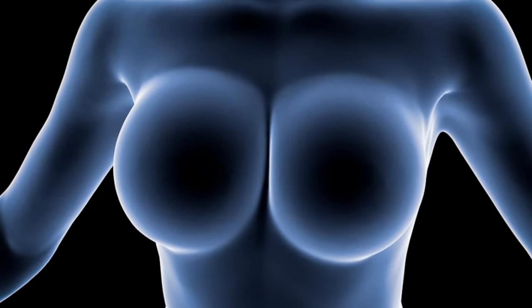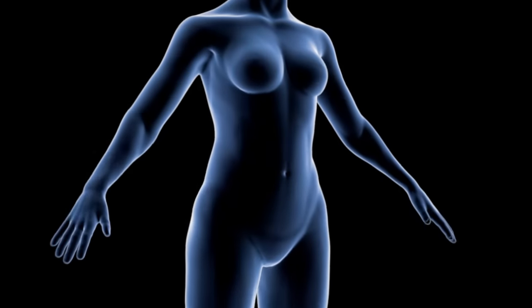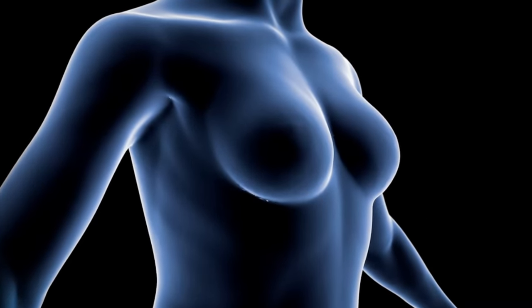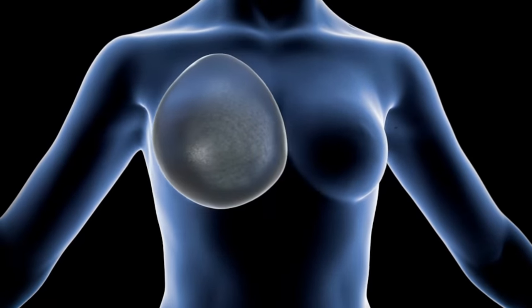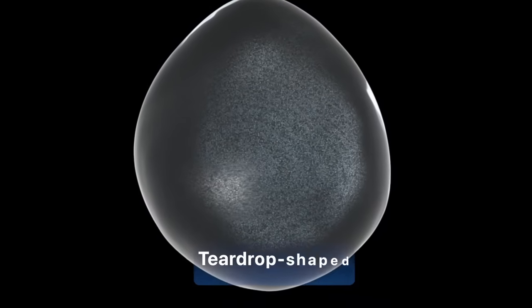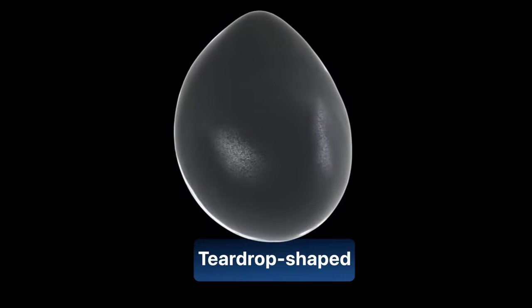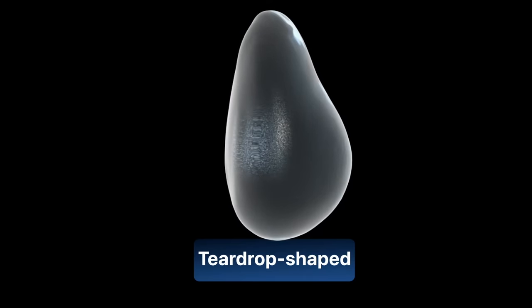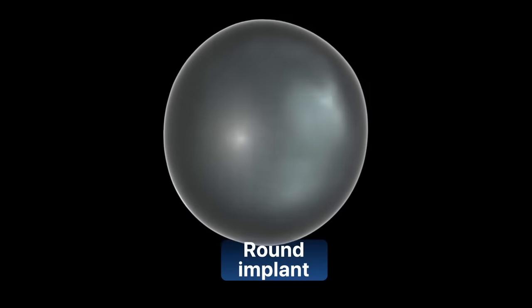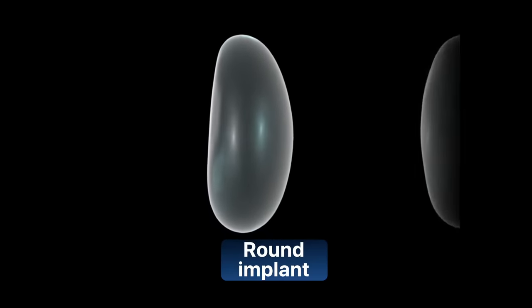To perform this surgery, breast implants are placed inside the chest, which can be round or teardrop shaped. The teardrop shape offers a more natural look, but over time it tends to lose its shape and look droopy. For this reason, the most used implant is the round one, since it maintains its shape for longer. To choose the implant, you will meet with your surgeon to discuss the right fit for you.